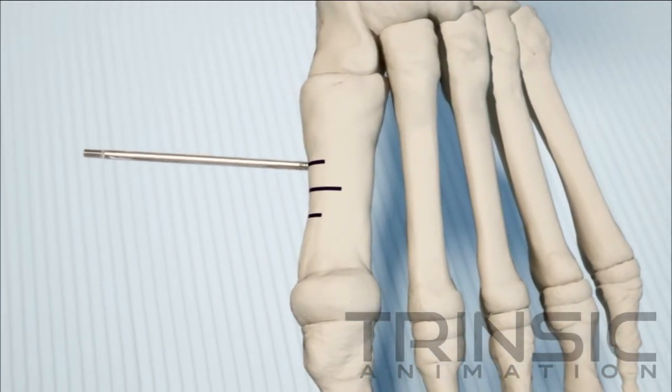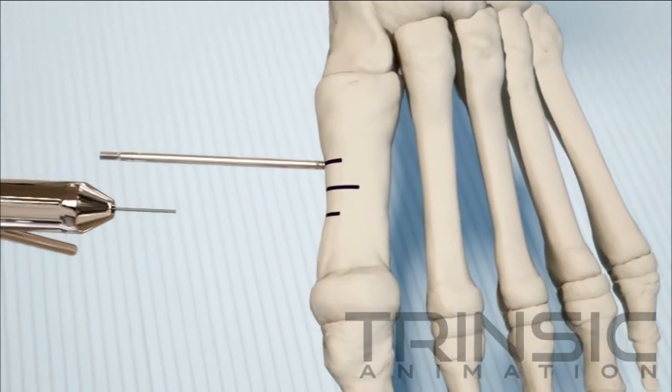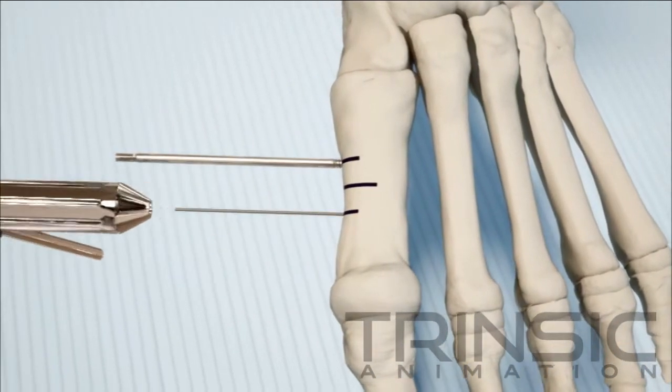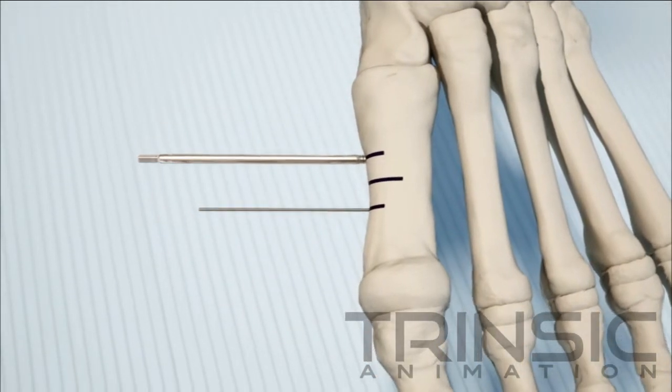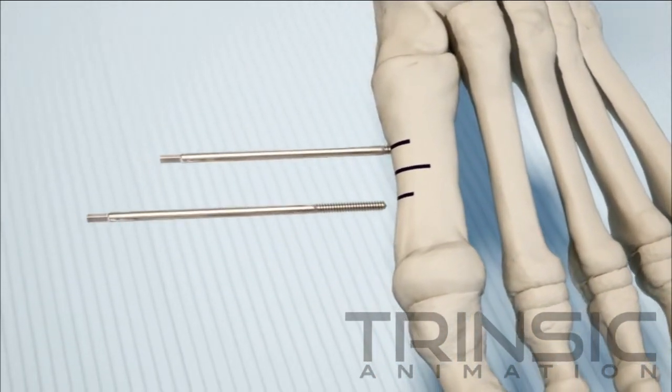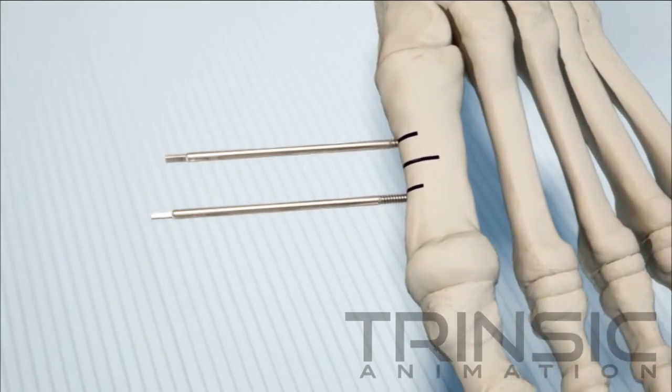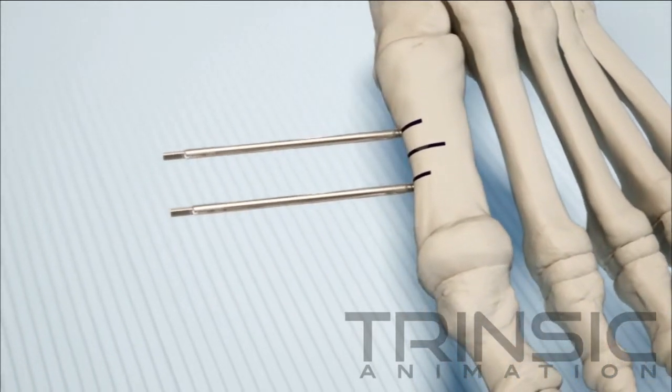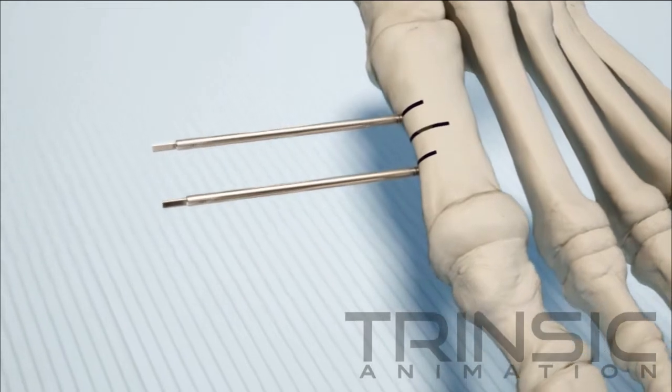Repeat the procedure for the second pin. Attempt to drive the wire parallel to the first half-pin. It is desirable but not essential to place all four pins exactly parallel to each other and in the same plane. The first two pins can be off as much as 30 degrees from each other.